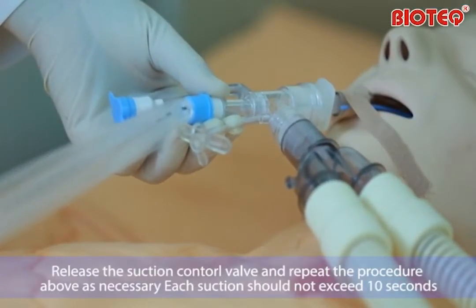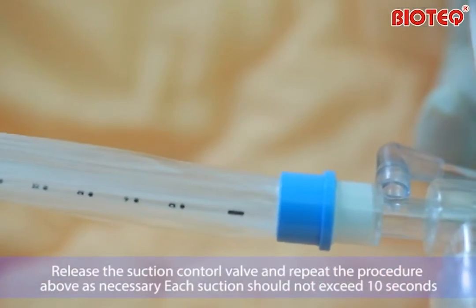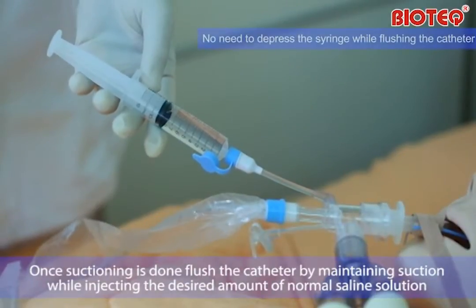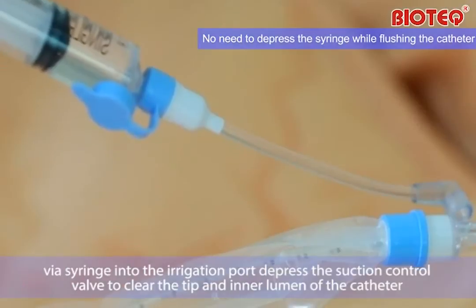Release the suction control valve and repeat the procedure above as necessary. Each suction should not exceed 10 seconds. Once suctioning is done, flush the catheter by maintaining suction while injecting the desired amount of normal saline solution via syringe into the irrigation port.